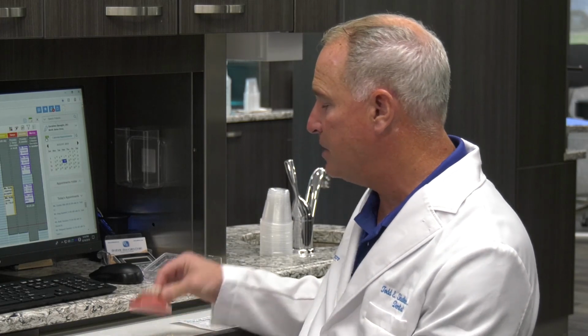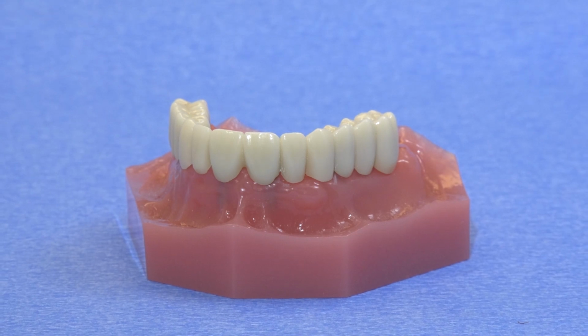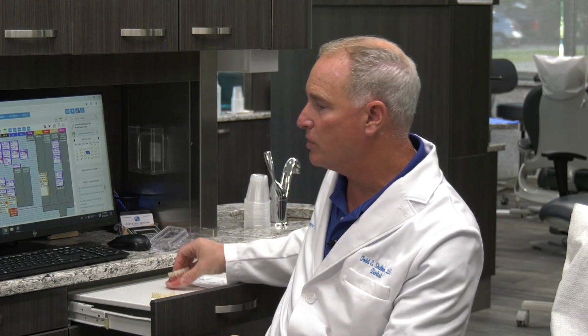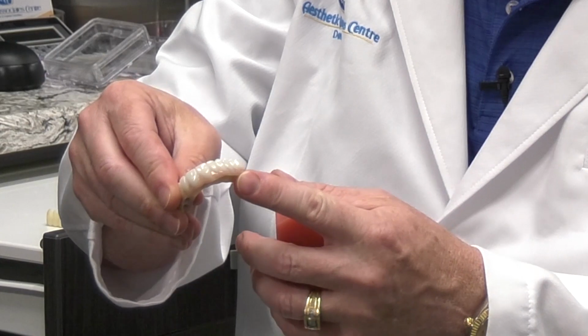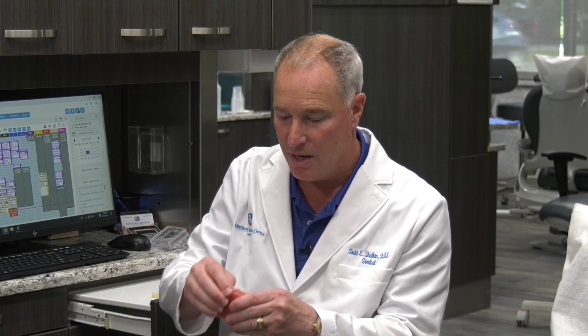In some cases you may, in some cases you may not. For example, in this case, we've got the porcelain teeth butting right against the gum line. You may not need pink porcelain. In other cases, you may need pink porcelain if you have to build a porcelain flange, for example, in a case like this, where you need to add extra pink gingiva. So it all depends on the specific situation. If the patient needs more lip fullness, you may need a much larger pink porcelain flange. So those are the things you need to communicate with our laboratory.